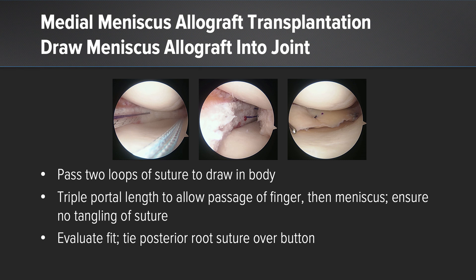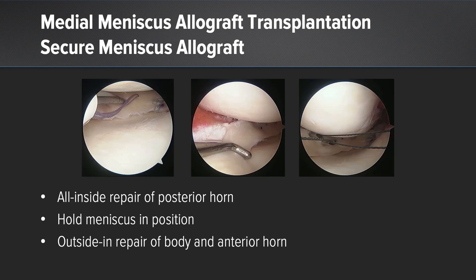I double or triple the portal length to allow passage first of my finger, then of the meniscus, to ensure no tangling of the suture. Then I evaluate the fit before tying the posterior root suture over a metallic button.